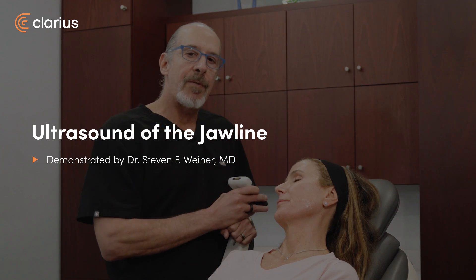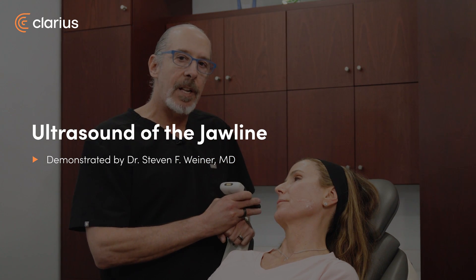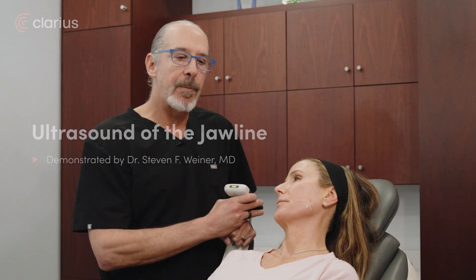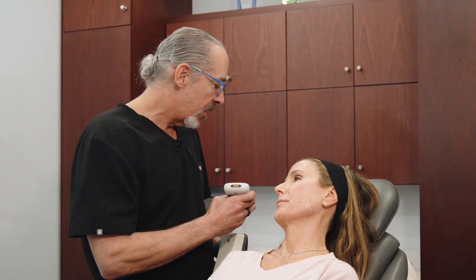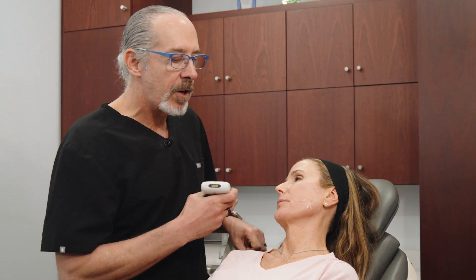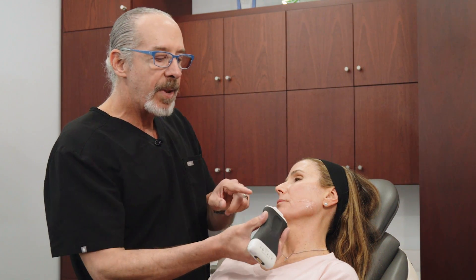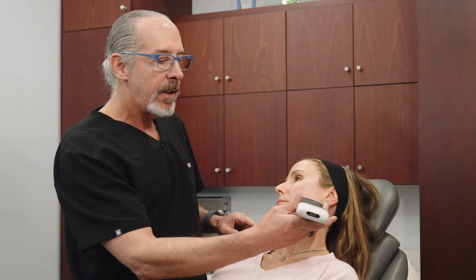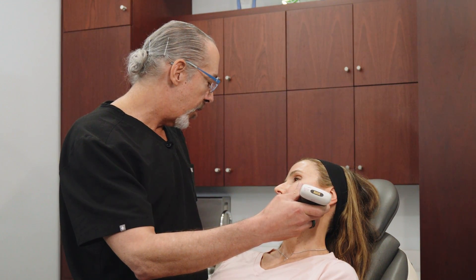This is Dr. Steve Weiner and the first area we're going to scan with our Clarius is going to be the mandible and parotid area. This is an area where it's great to start to learn your anatomy and how to use your scanner. So make sure that the little nub is pointed to the patient's right, and here we go.